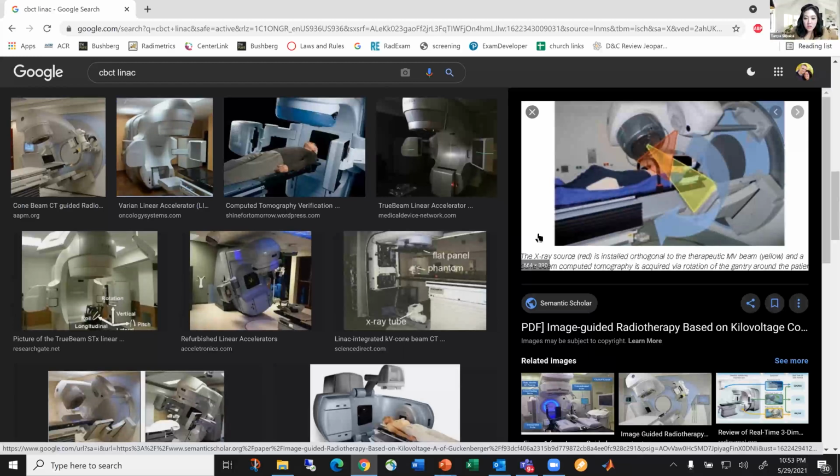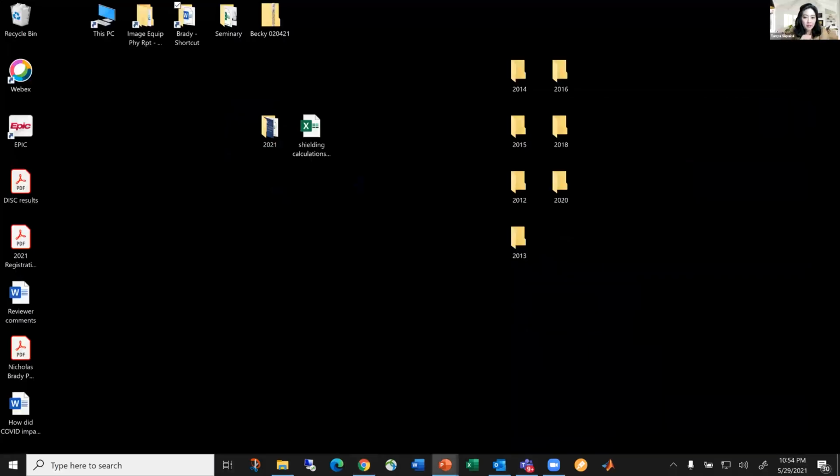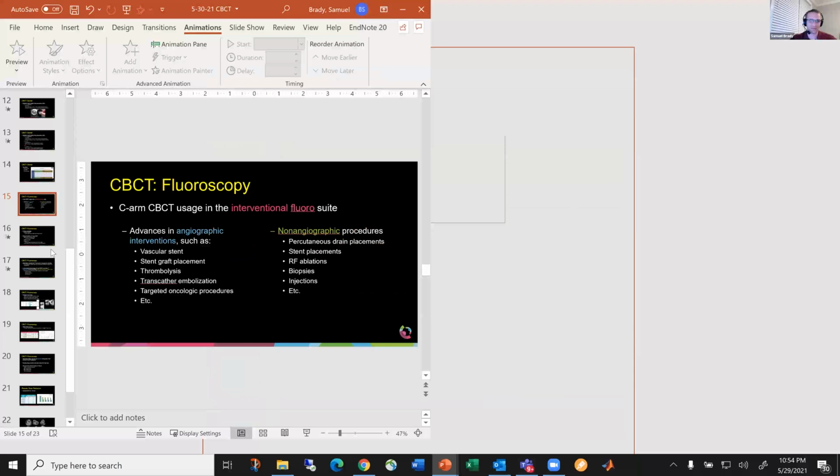There are a couple of questions, so one from the chat box. If we want to compare the dose metric on the cone beam CT to the conventional CT, do we still use CTDI volume, or do we use DAP to compare? Yeah, I would use volume CTDI.